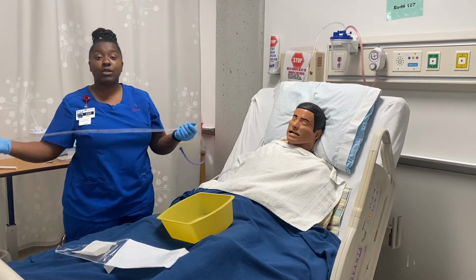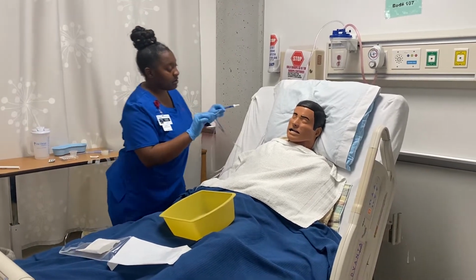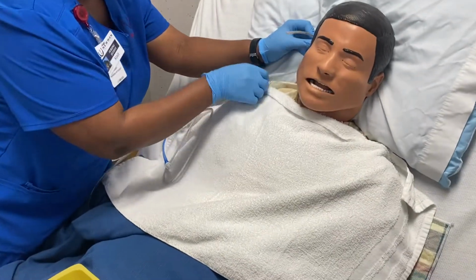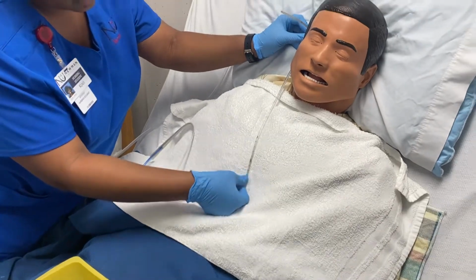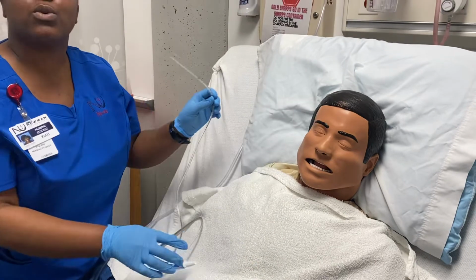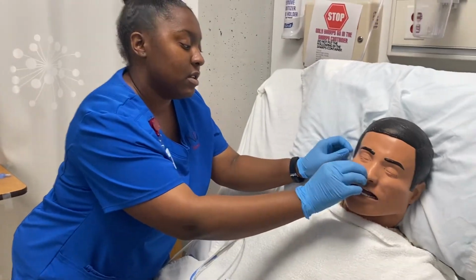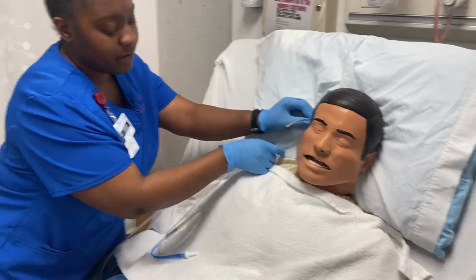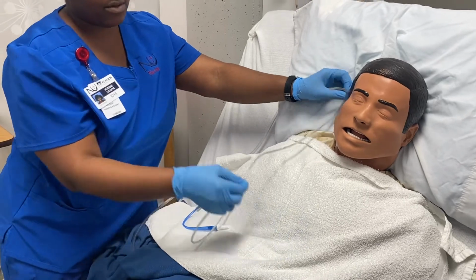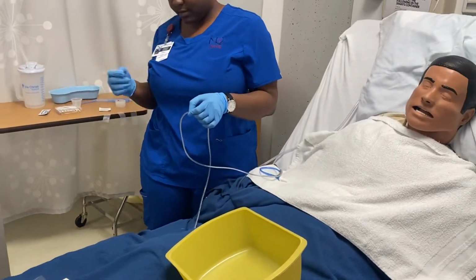Alright, so now I'm going to measure the tubing to the patient's nose. So I'm going to start with nose to top of the ear, and I'm going to go down to the xiphoid process. So that's about 55. And then I'm going to just measure twice just in case. So I'm going to start at the nose, top of the ear, down to the xiphoid process. Okay, so that was about 55.